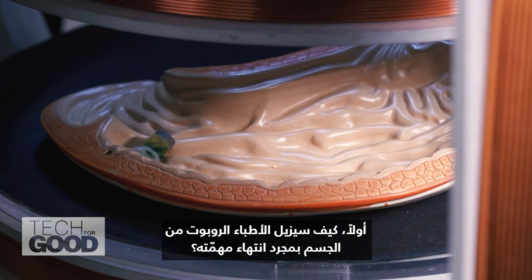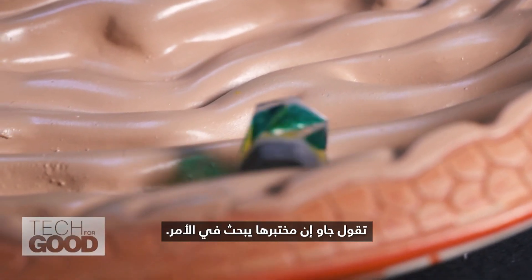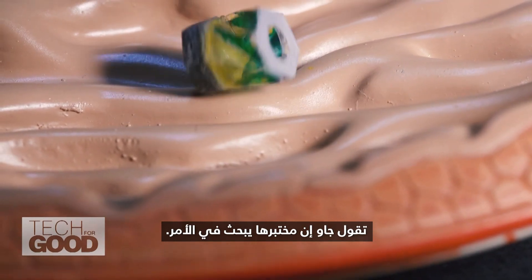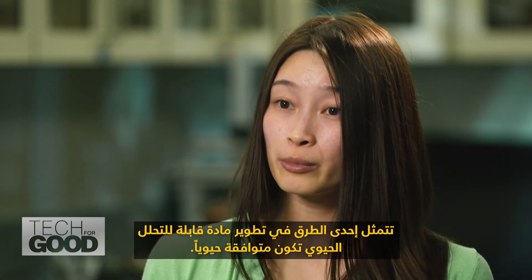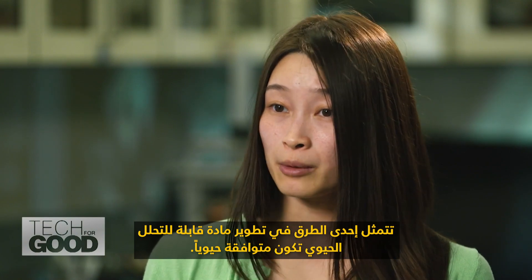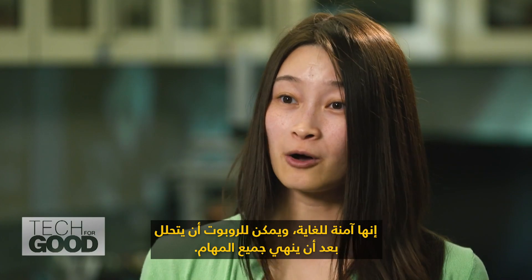While the possibilities for new forms of treatment are certainly intriguing, questions still remain. First, how will doctors remove the robot from the body once it's finished its task? One way is to develop biodegradable material that is biocompatible — it's very safe and the robot can degrade after it finishes all its tasks.